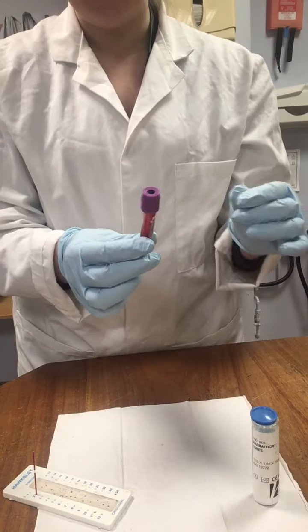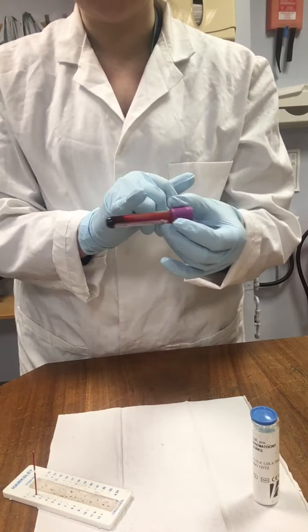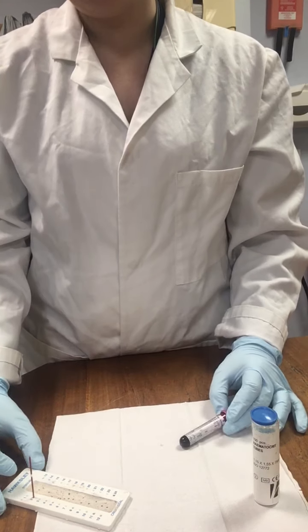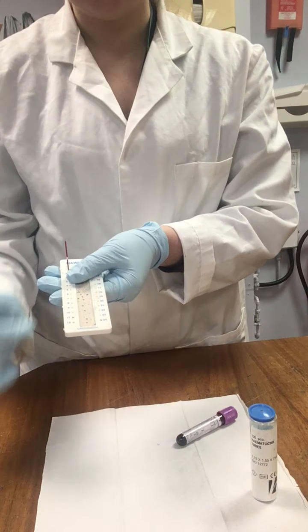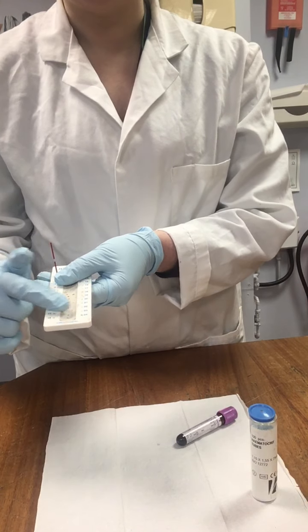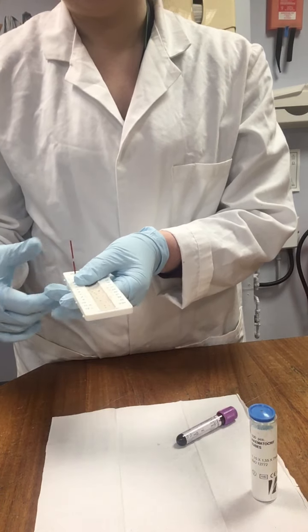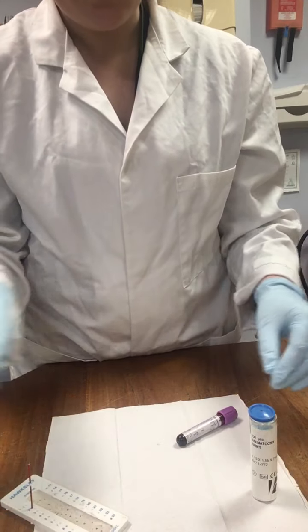We've got our blood sample. We've previously inverted it, so it's now nice and constituted. And what we're going to use is some hematocrit putty in this instance, which is going to provide an obstruction or a plug for the end of our sample.